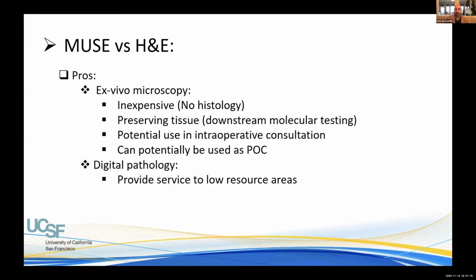So in the traditional way, you have no choice but to damage the tissue and then sometimes re-biopsy the person for doing other tests. But here we can examine it without any harm to the tissue and then decide, do you want to send it for molecular or not?